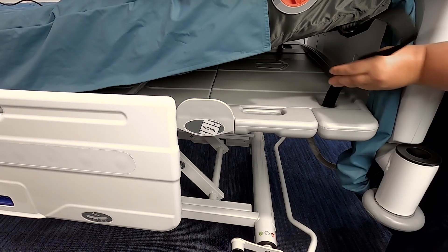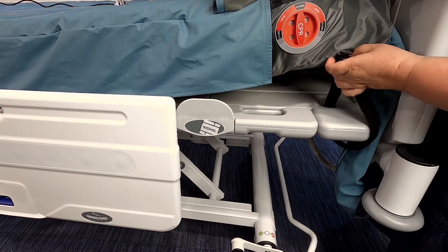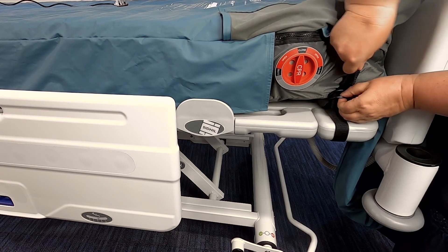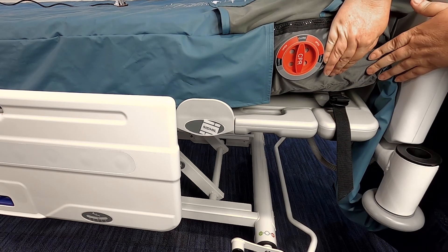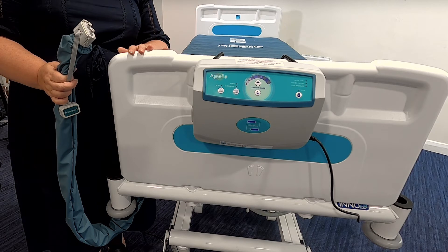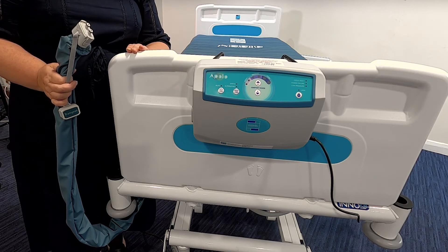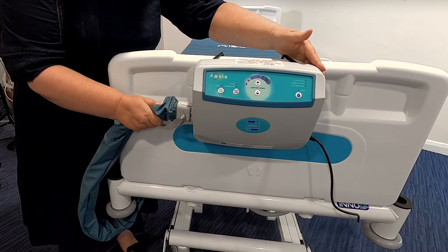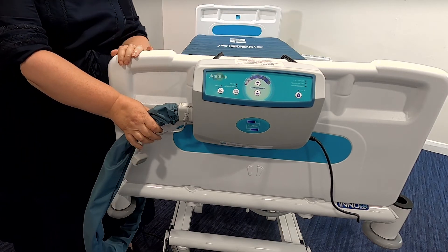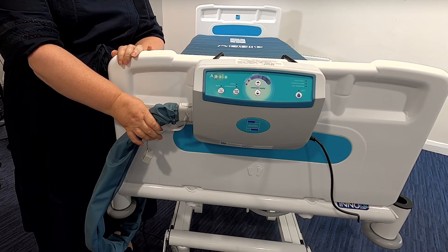Attach the mattress straps to the moving parts of the bed frame, ensuring they are not twisted. Position the pump unit securely to the footboard of the bed using the integral hooks that you see here, or a pump unit holder if this is provided with the bed you are using. Attach the air connector using the quick connector by aligning with the ports on the pump unit and pushing into place, ensuring the hose does not kink or become trapped between the parts of the bed frame.